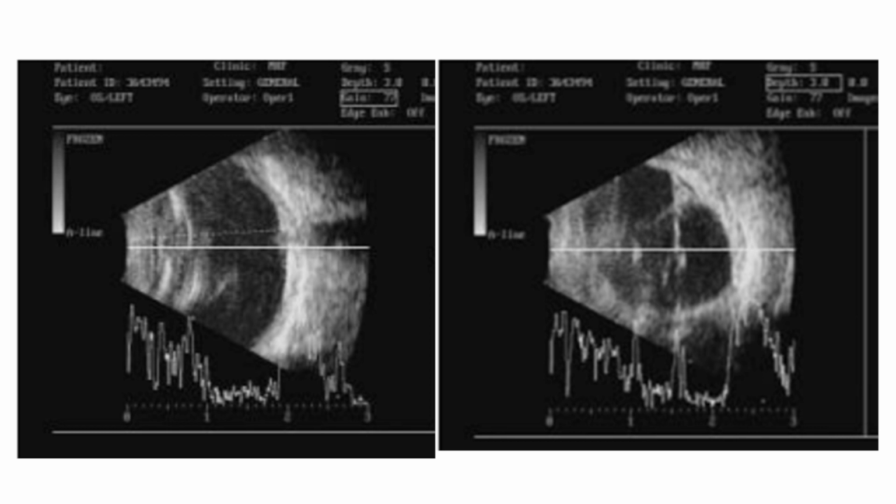The image is slightly curved, but it appears to be here somewhere. What are those two lines joining? This is not an optic disc, because the optic disc shadow is not there. What is there on the optic disc shadow? I think that's not a disc area, right?